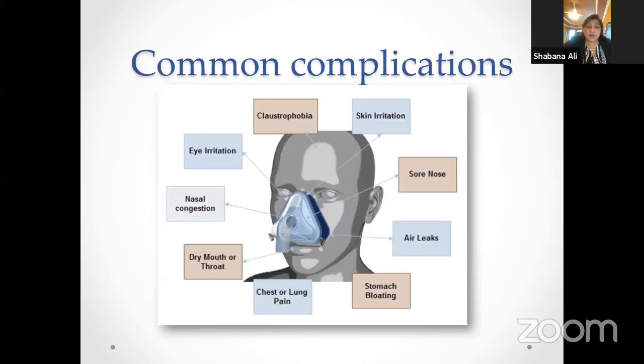Next slide. So these are some of the common complications when we put the patient on CPAP. Patients become claustrophobic because there's a mask with a lot of pressure on the face. They may become claustrophobic, and they may not let you keep the mask on all the time. Of course, skin irritation, because the mask has to be tightly fit on the nasal and mouth area. Sometimes it breaks the skin, and we have seen many patients with so many skin tears all over the mask area, especially the nasal bridge.